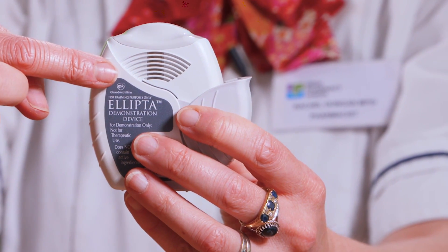Be sure not to block the air vent with your fingers. Inhale through your mouth, not through your nose. Remove the inhaler from your mouth and hold your breath for 10 seconds or as close to 10 seconds as you can. Then breathe out slowly but do not breathe out into the inhaler.